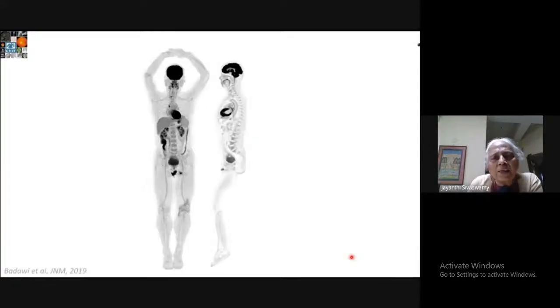Finally, the last class of image that you should be aware of, but probably are not familiar with because it is a bit rare, is nuclear imaging. When you want to understand what's wrong, whether there is cancer and whether the cancer has spread, then you go for nuclear imaging. This is a 3D image of the full body because we want to know if the cancer has spread. You can see one view, and this is the side view and so on.